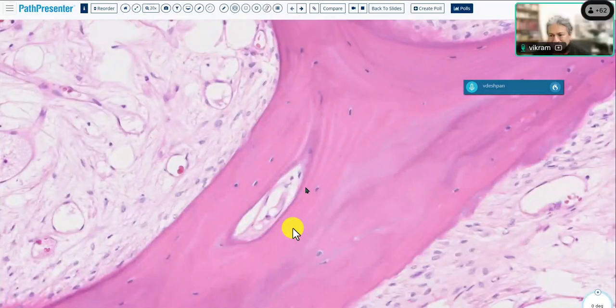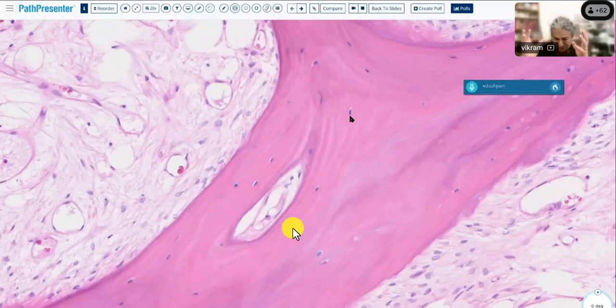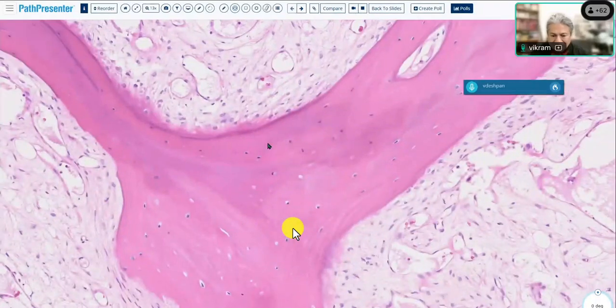So beautiful lamellae, right? And then these are osteocyte nuclei. And remember, these osteocytes are in a space, a lacunar space, and you have small dark nuclei, and they are scattered throughout. If you look here, there's a lot more osteocyte nuclei, and that's because this bone is relatively new. It isn't as new as what I would call woven bone, but it is new bone.